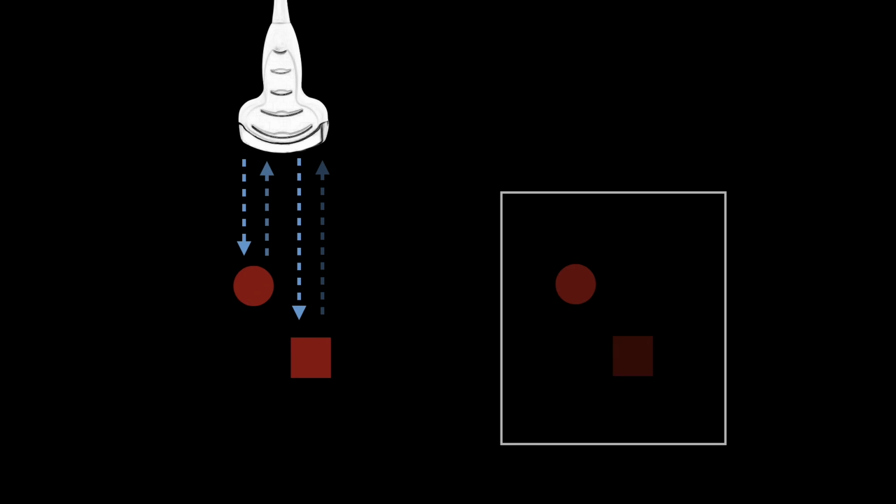And also, we are listening for the sounds that we hear back within that one pulse cycle. So think about it this way. If I send a pulse, and then it goes out and keeps going, and I send another pulse, the first one comes back and I display it, right? I don't necessarily know if it could have come back later. The assumption is it came back within the one pulse cycle, but this one actually took 2 pulse cycles. So it should be really, really deep, but it's going to display it higher up, right? Again, a crude way of understanding this, but what we are saying is when we break these assumptions that the sound goes out, it bounces off something, and it comes back, we are left with some artifacts, right?